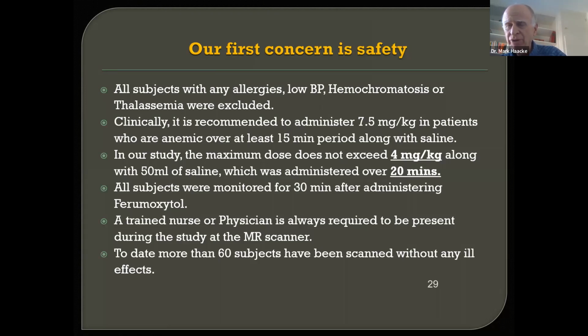All subjects are monitored for half an hour after they come out of the magnet. We always have a nurse or physician present while we're doing this. And to date, we've done more than 60 cases, and they've all been scanned without any ill effects. So we've had no complaints, whereas sometimes when you get normal gadolinium, people will come out and say they had this metal taste in their mouth.